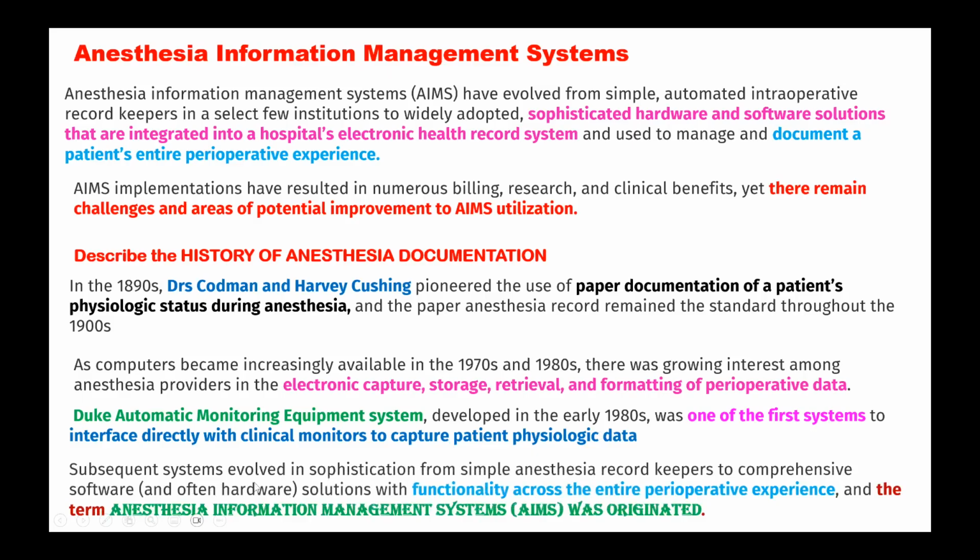So the subsequent systems evolved in sophistication from simple anesthesia record keeping to using software that itself will give some solutions for you, so that the functionality across the entire perioperative experience was made into the anesthesia information management system.